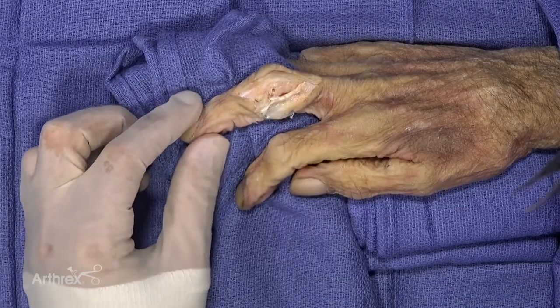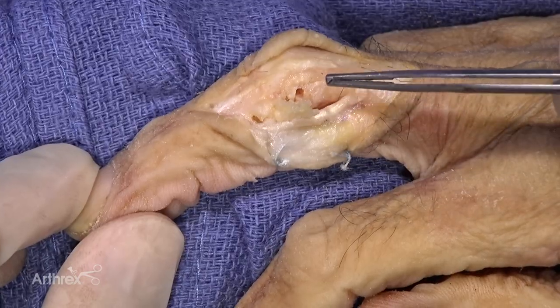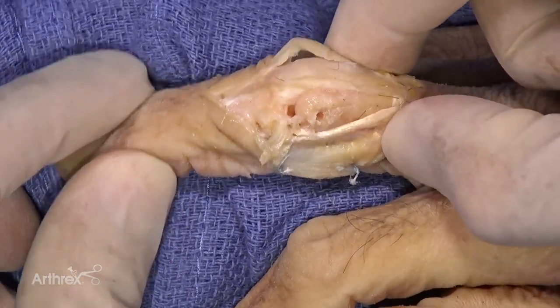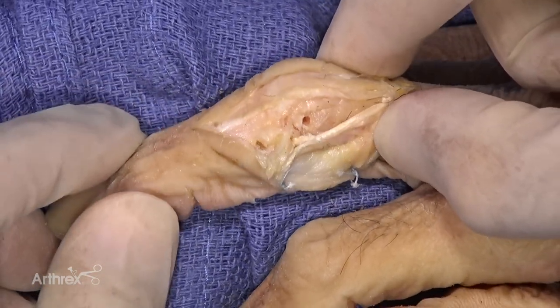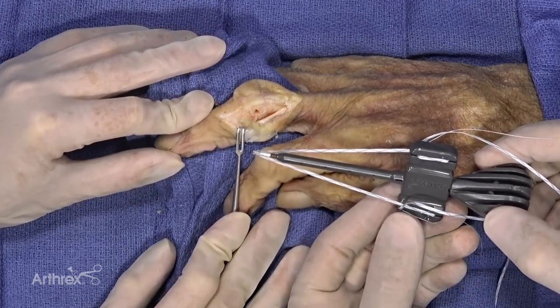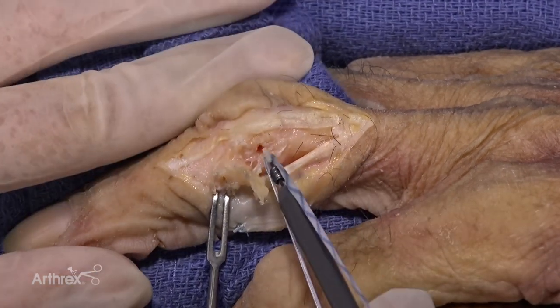So you can see here we have a simulated PIP collateral ligament tear. The ligament has been lifted off proximally where it's torn from. You can see the instability and how much this gap is open in the joint prior to the repair. Now that we have our anchor loaded, with our 1.3 millimeter suture tape and our 4-0 fiber wire, we'll go ahead and place that in the proximal side first.